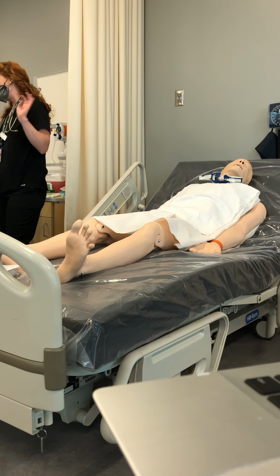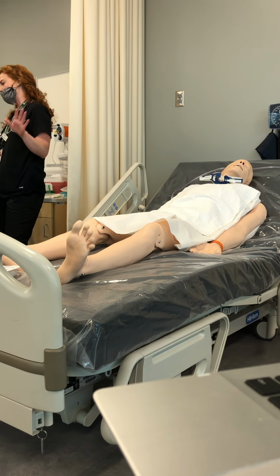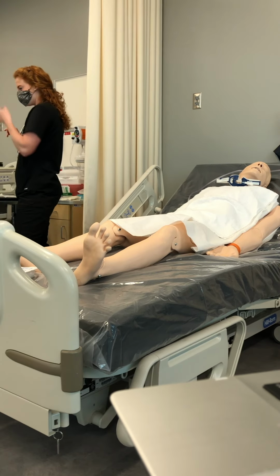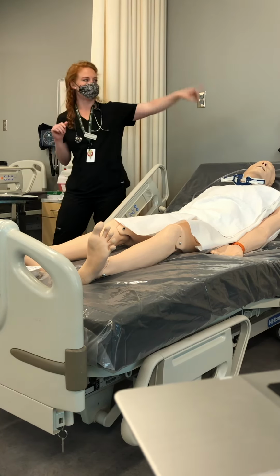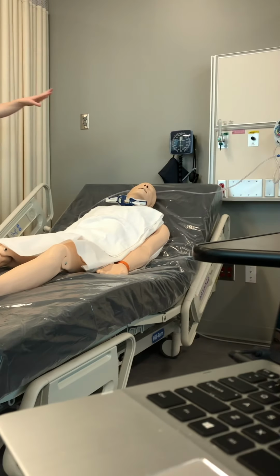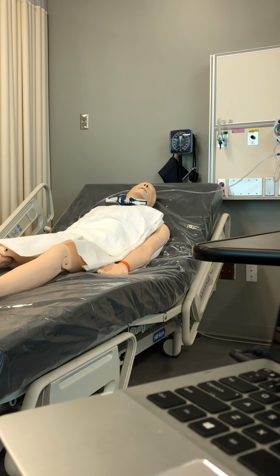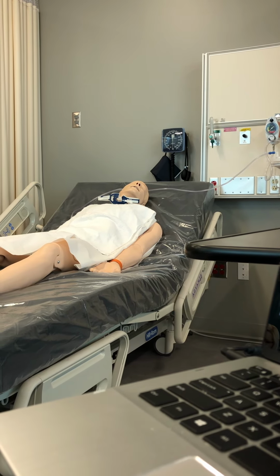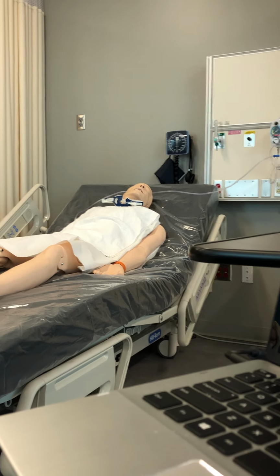So raise the bed, place the patient in semi-Fowler's or Fowler's position. That's fine. Perform hand hygiene. Verify that the pressure suction source will not exceed 120. That's going to be over there, and that will just be verbalized again. The suction's not actually working. Open the suction kit and don sterile gloves. So let's see what's in here.